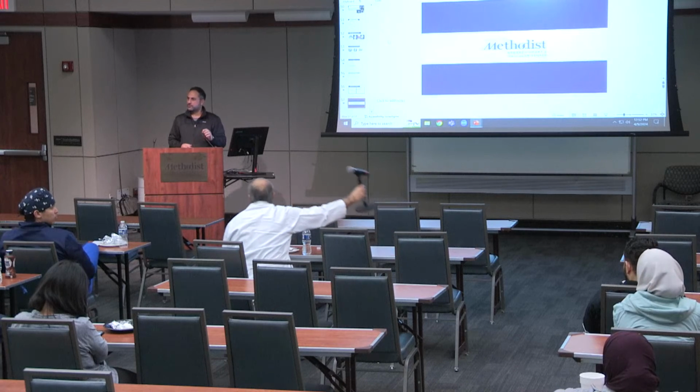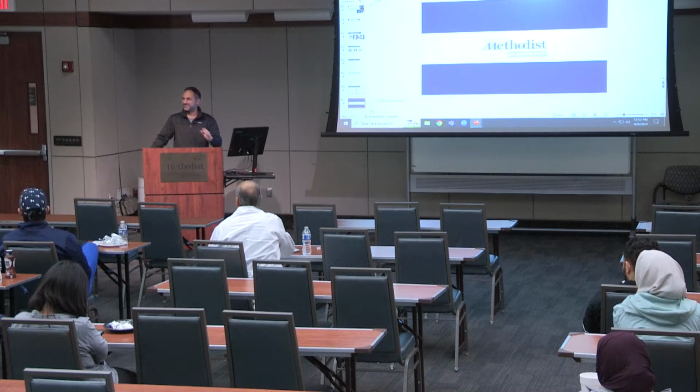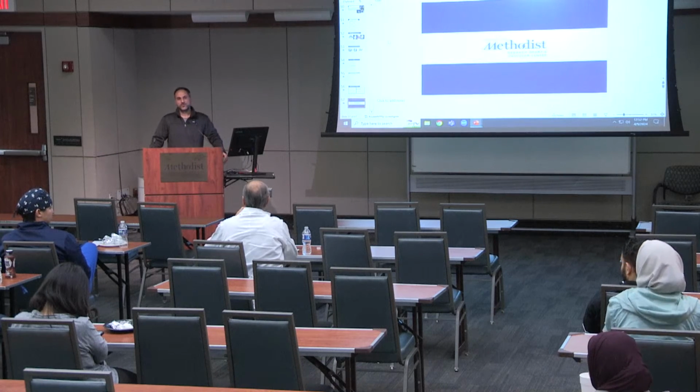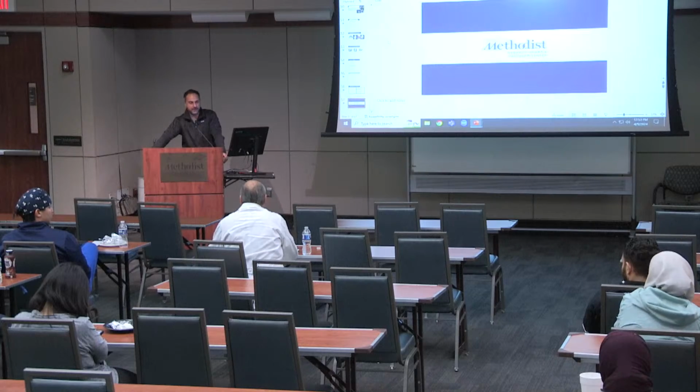Dr. Faza, do you want to join for echo questions? Okay, first off, really very nice job. I think you guys did a very nice balanced approach. I want to probe you a little bit further with regard to AFib. People always talk about that. Maybe tell me from the echo side how you approach it, and is all AFib something that can't be done, or only some AFib? And then Carlos, from the MRI side, how you approach it.